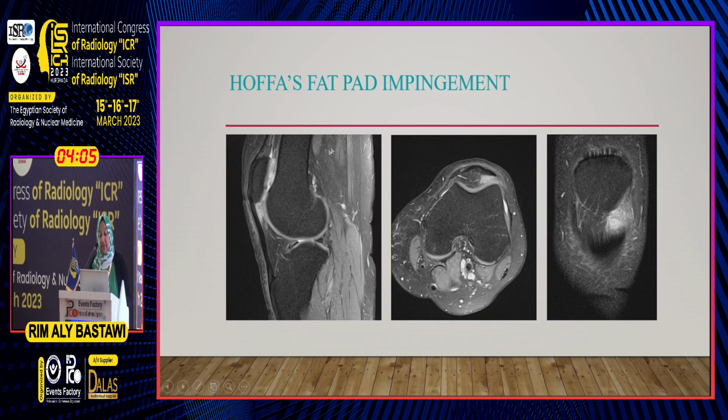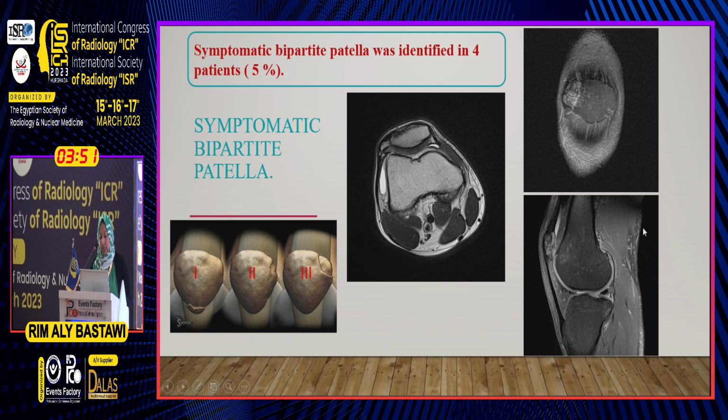The Hoffa's fat pad impingement was diagnosed by the presence of soft tissue edema at this characteristic location of superior lateral part of Hoffa's fat pad, which was also nicely demonstrated in axial and coronal sequences.